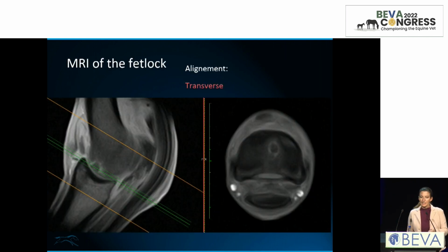So this is just a little simple example of that. We all can see this very large sagittal ridge irregularity and defect here. And if we are transversing through in that fashion, it is very difficult to say how the border of that lesion looks. On the sagittal, we always have volume averaging of the sagittal ridge, so it's not that clear. So you really want to have a really nice transverse through that area of pathology.